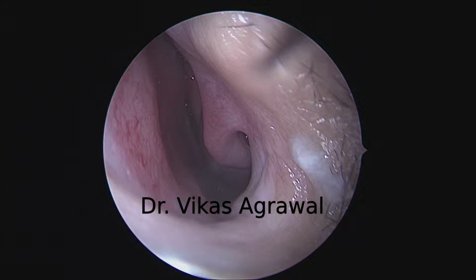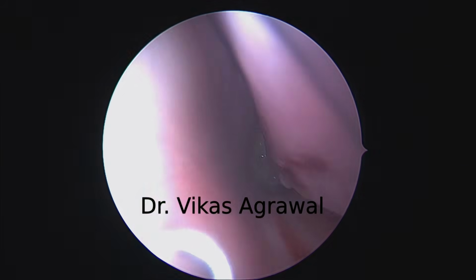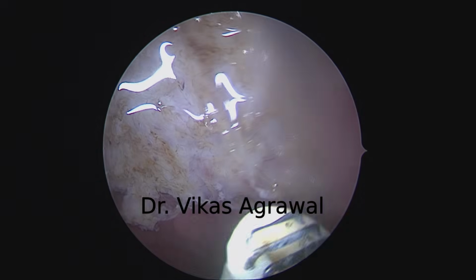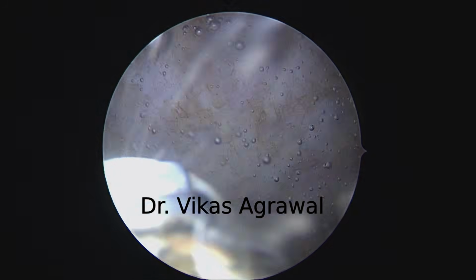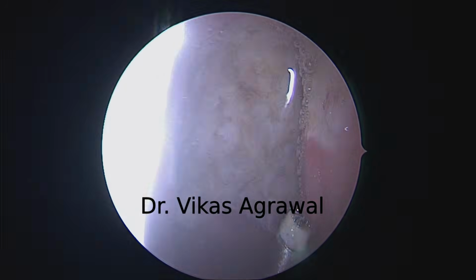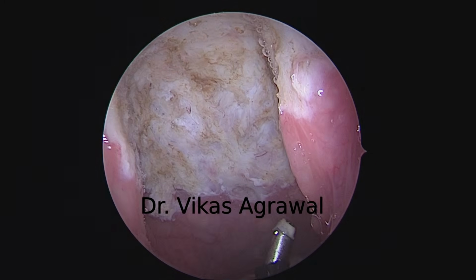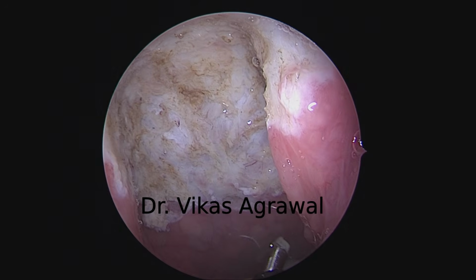So I'll just show you the other side once again. Practically no bleeding. Can you pour some saline, sister? Thank you. And you can see the complete adenoidectomy.